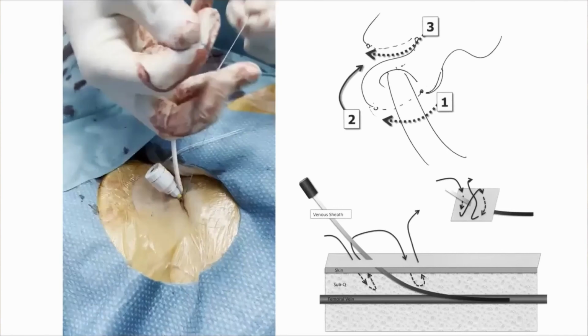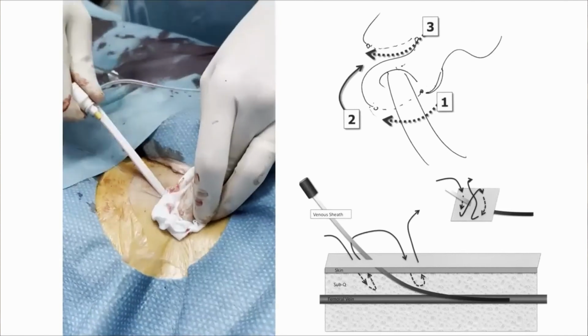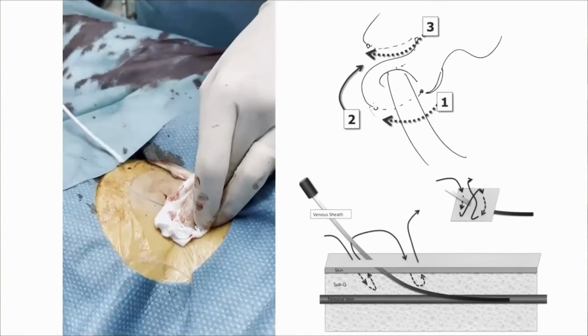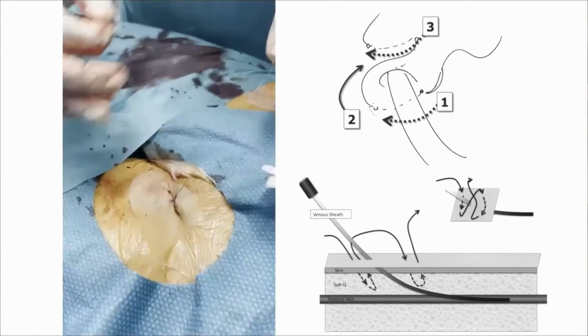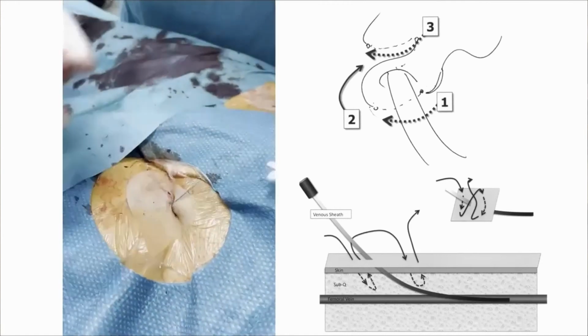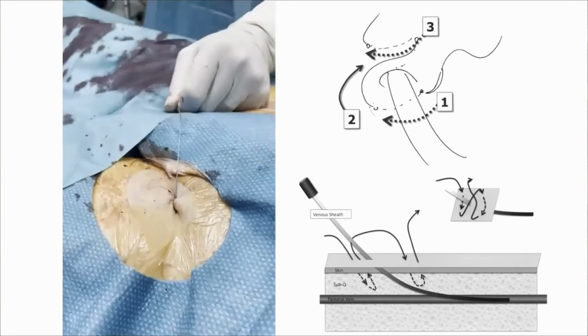During sheath removal, the knot is tied with the 2 ends across the puncture. And the final result shows the involution of the encompassed tissue by the suture, which results in a complete closure of the access site. Like this.